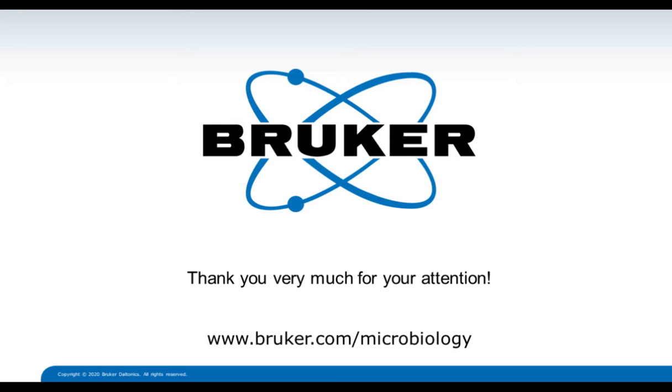So the Pathfinder throughput is approximately a full target plate in an hour that can be prepared overall. So it's not mainly the speed that makes the Pathfinder, but the precision, the automation, and the very good documentation of the process, including photographs.